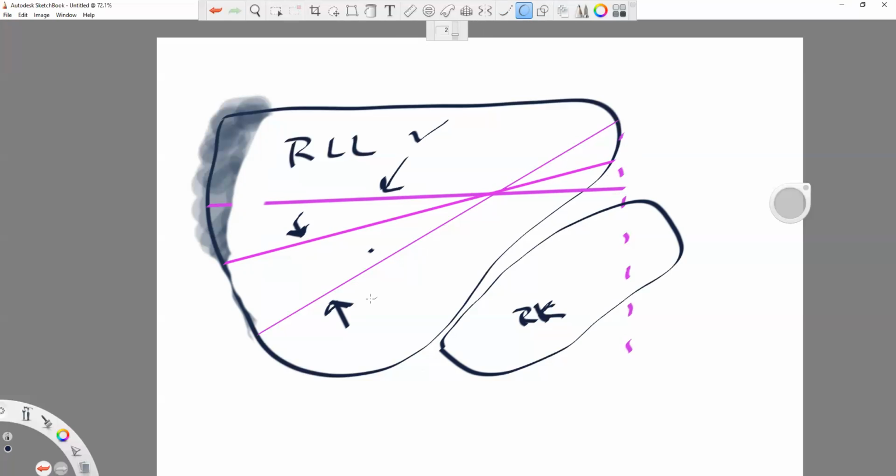This is what everyone's doing. Oh my God, everyone takes this image, that measurement. Correct is cranial caudal. I'm just saying we're going to do our best to make it as cranial caudal as possible. We're going to do our best for that.